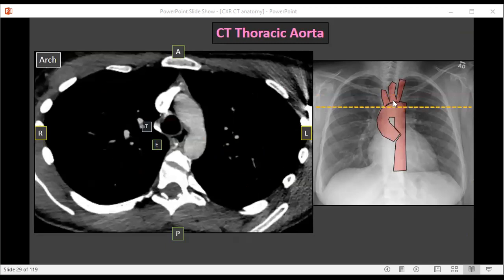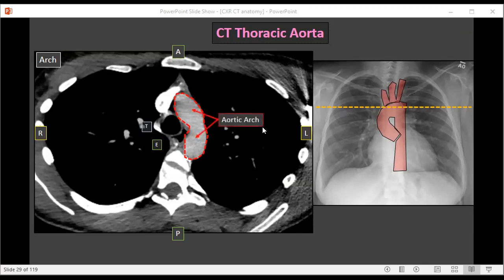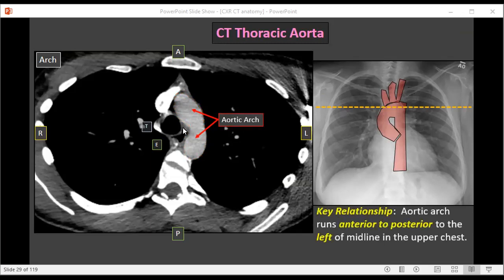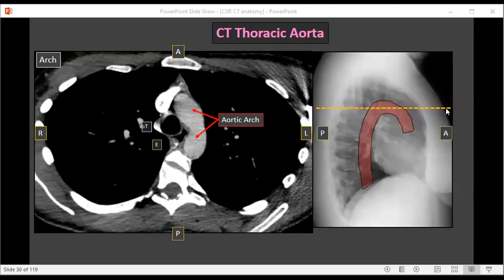Coming down a little bit further, below the arch vessels, we arrive at the level of the aortic arch. The aortic arch runs anterior to posterior, so it's going to appear more tubular on CT than the circular arch vessels that ran up and down. The aortic arch is to the left of midline — here's the spine — and just to the left of the trachea and esophagus. Remember the arch vessels were anterior and to the left of the trachea; the aortic arch is straight to the left of the trachea, just a little bit lower. This corresponds to that anterior-to-posterior course we see on the lateral chest X-ray view.